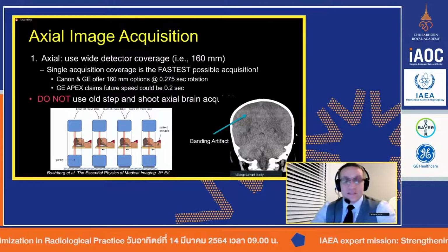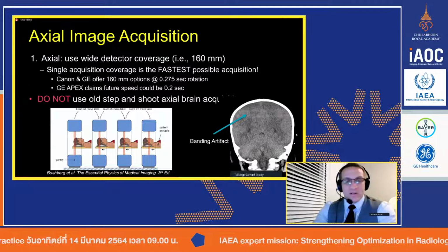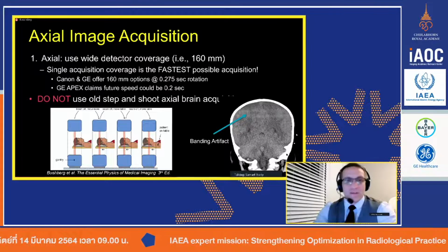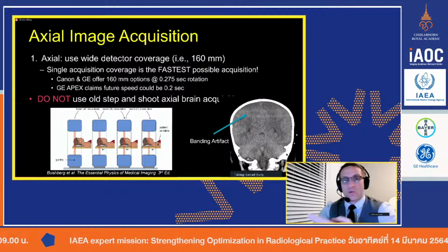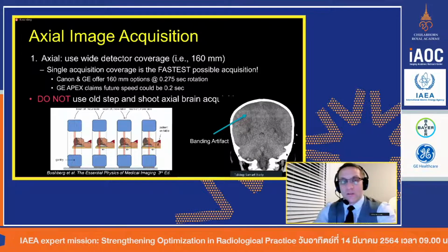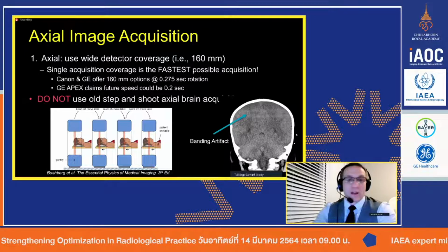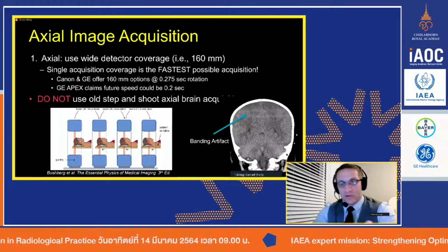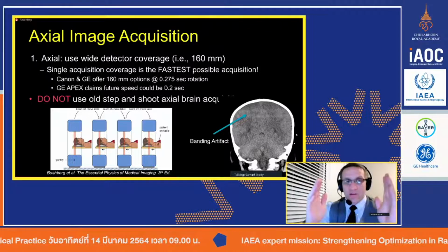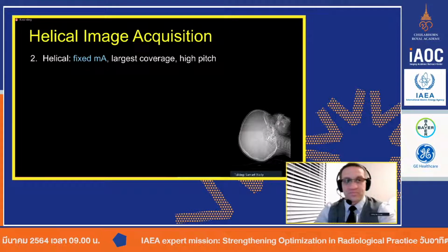That is the slowest way to image. And with modern technology, this is probably not the best way. It's typically the highest dose and the slowest way to acquire. So it's more prone to artifacts, to misregistration, etc. I highly do not recommend this if you have the technology to do either wide angle, like I said, or any of the next two options, which is using helical.